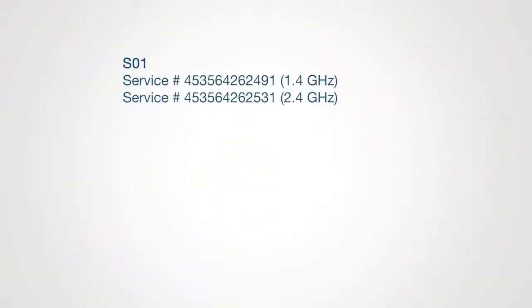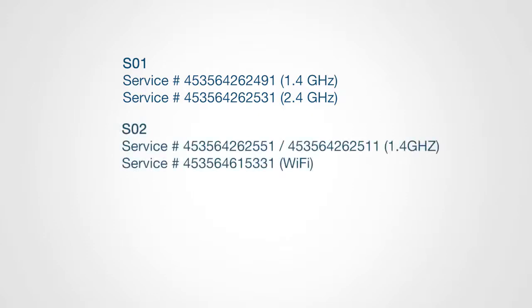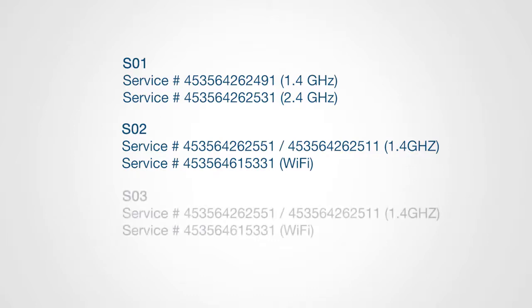S01 ends with 2491. S02 ends with 2511. S03 will also end with 2511. The way to identify the difference is going to be to boot up the telemetry MX40 unit, and you can check to see if it's different between S02 and S03.